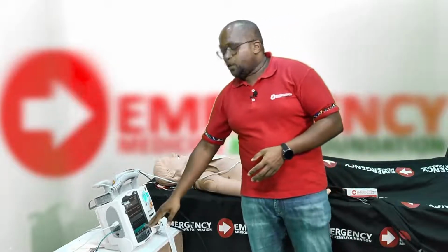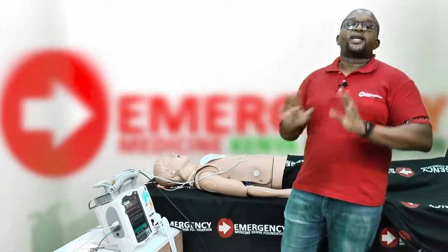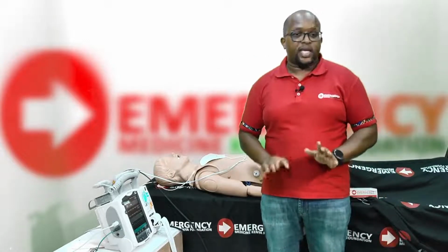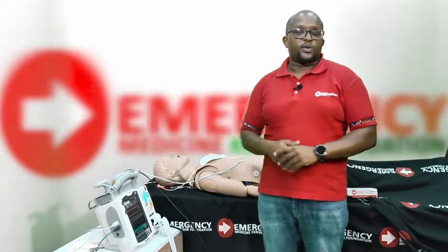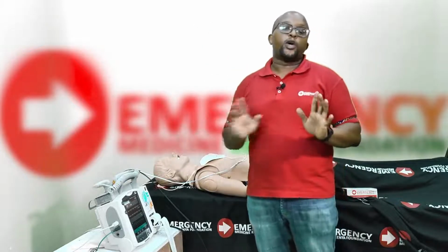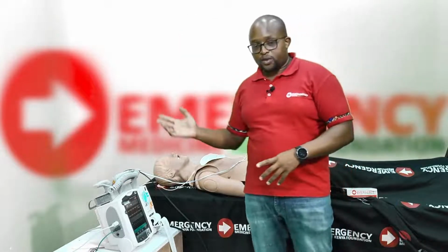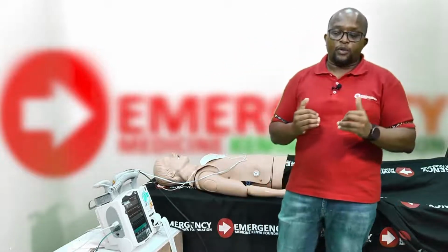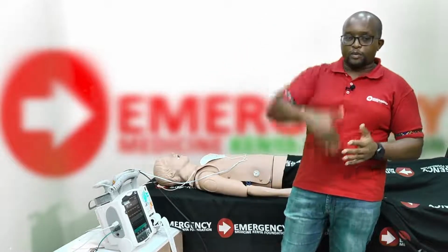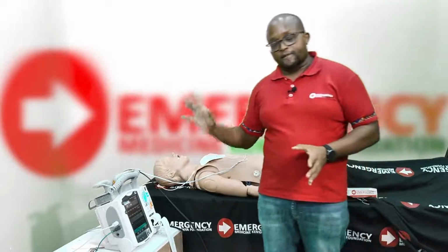So in a fixed mode, the machine will deliver the electricity consistently, regardless of what the patient's heart rate is. If the patient's heart rate goes maybe to 75, the machine will still pace the patient at 70. It will not go into a standby mode. In demand mode, if the patient's heart rate goes above what you set, then the machine will go into a standby mode, waiting for the heart rate to drop below what you set. But in the emergency care setting, you want to be on fixed mode.